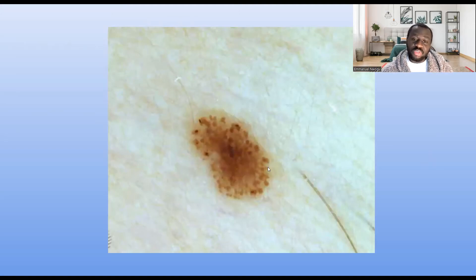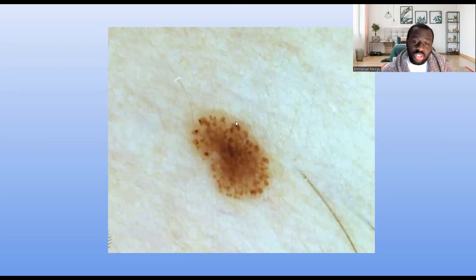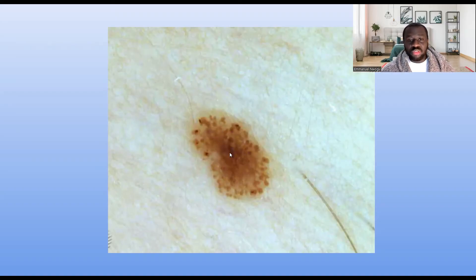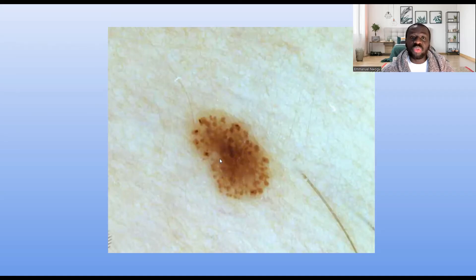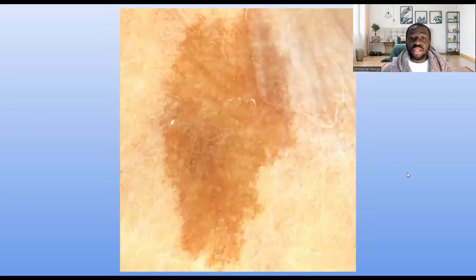Let's have a look at this lesion. You can see the presence of some globules — dots and globules at the periphery. This is likely a benign melanocytic nevus in a young person; this lesion is still growing, but it's benign. If you draw an imaginary line, it divides it into symmetrical halves. It has a regular margin, and the level of pigmentation appears to be uniform, even though there are a few slightly darker areas. In general, this lesion looks homogeneously pigmented — it's purely a benign melanocytic nevus.